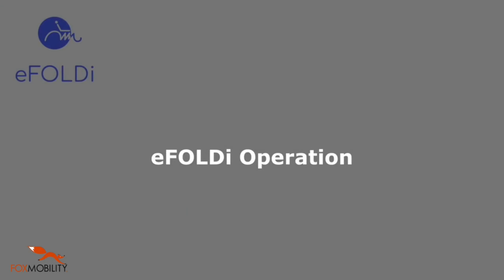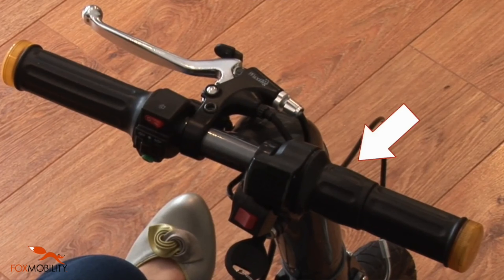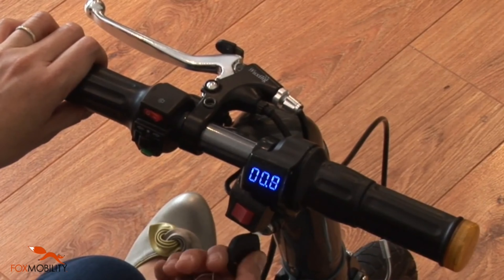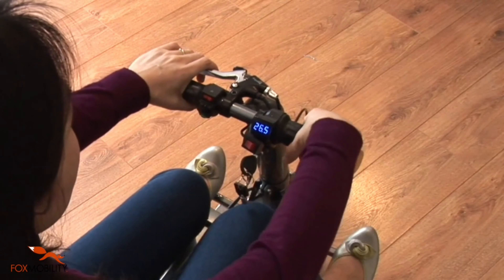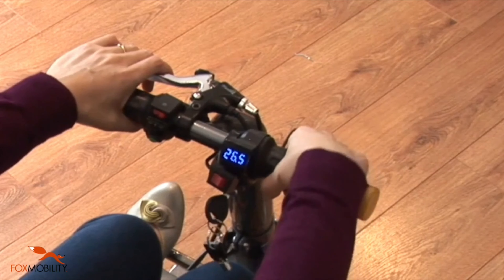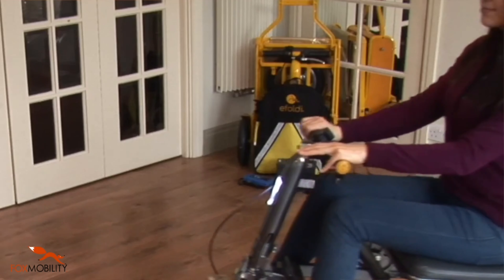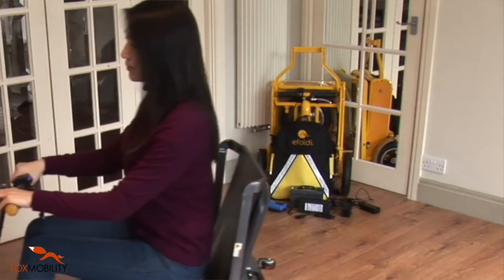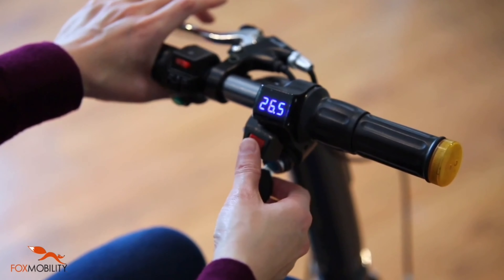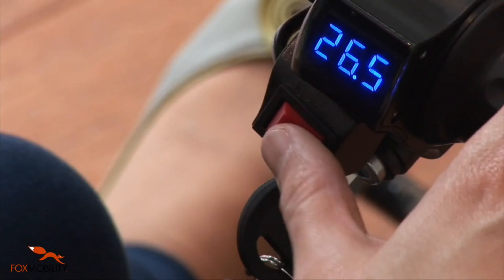Operating the eFoldie. The throttle is located on the right handle. To drive the eFoldie, simply turn the throttle towards yourself. It is always recommended to check the gear and to turn the throttle slowly. Your eFoldie is designed with both forward and reverse gears. Travelling directions and maximum speeds are controlled by a three-way switch on the handlebar.